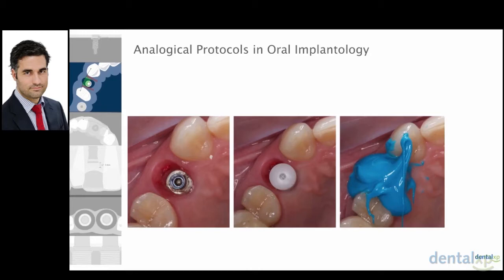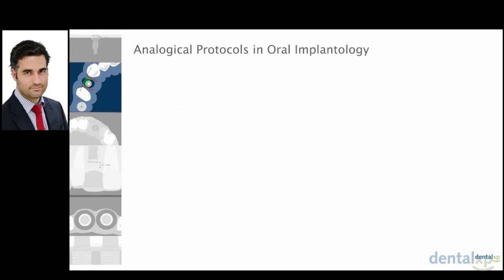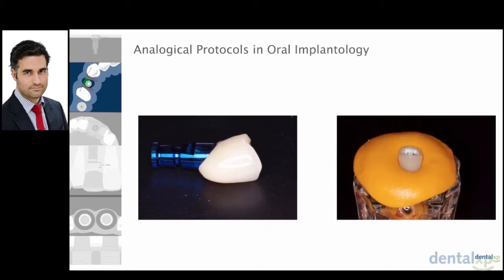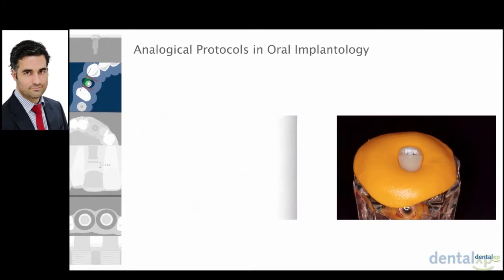So what we do is to place a cap in the implant. We place some silicone. This is a protocol that was published. Various authors published this protocol, one of them Iñaki Gamborena. And then you get your provisional, you submerge your provisional in a silicone with an analog.